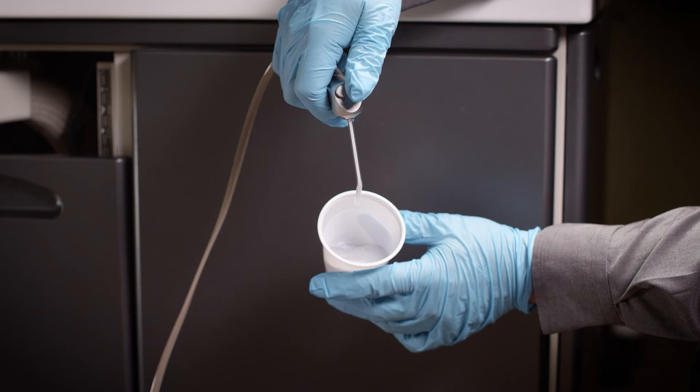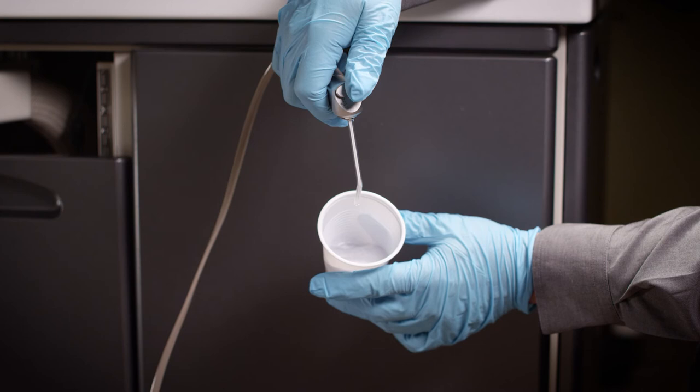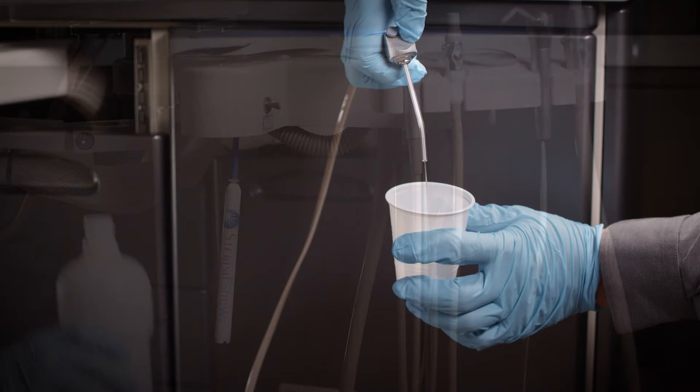When you return the next business day, fill the bottle leaving an airspace at least one inch from the top of the bottle. Then purge all water lines and hand pieces attached to the operatory unit until the water runs clear. You're all done.